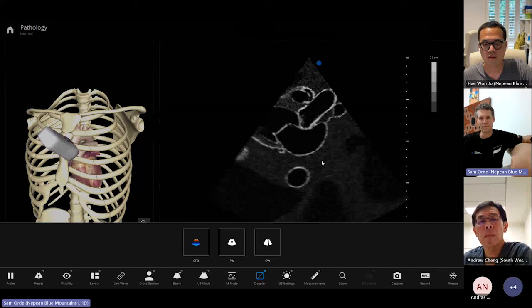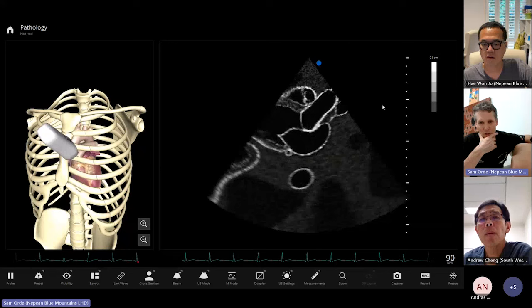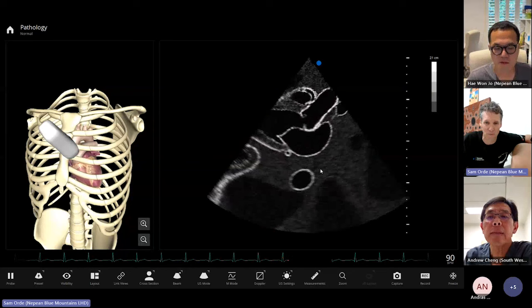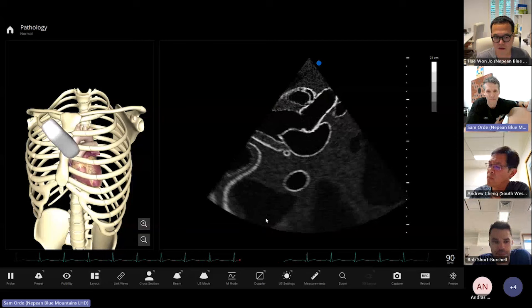Increase the depth so you can check for pleural or pericardial effusions. To differentiate them: look at the location of fluid in relation to the descending aorta. The descending aorta sits here — if fluid is in front of it and doesn't go behind the left atrium, that's pericardial. If fluid is behind the descending aorta, that's a pleural effusion.